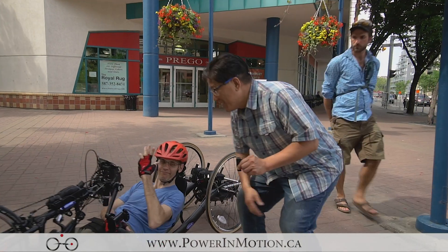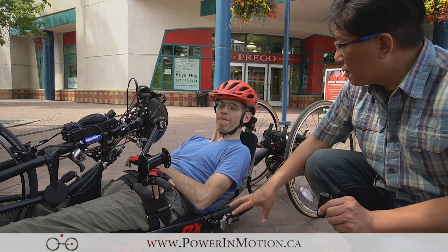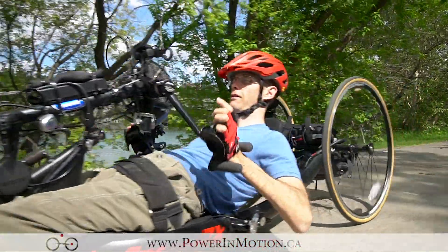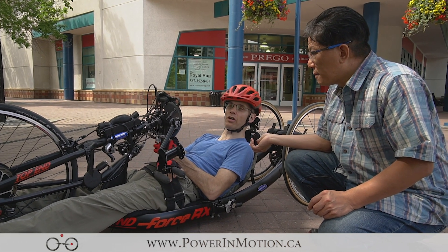I have Ian here — Ian is our customer. Can you tell me about this hand cycle? For about five years now I've been an avid hand cyclist, but certainly been limited mostly on hills and long, long duration rides.